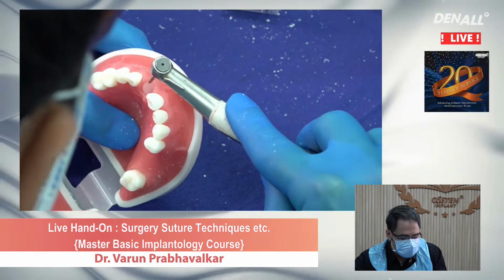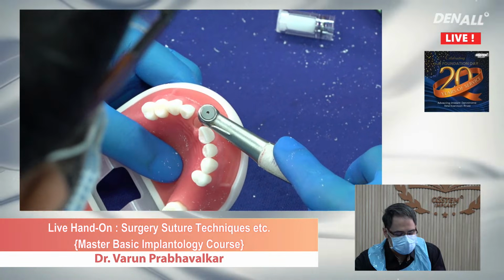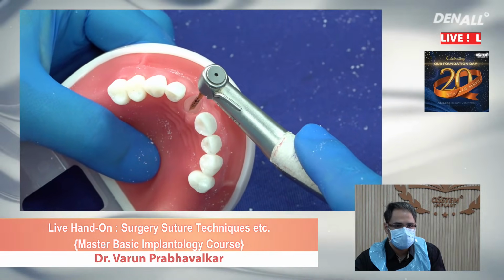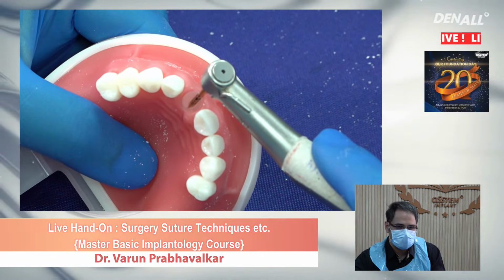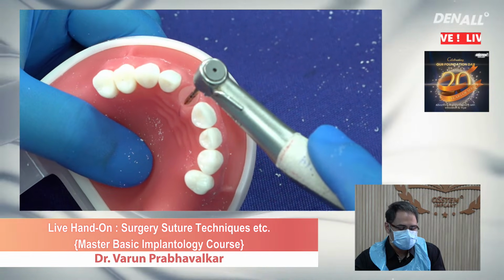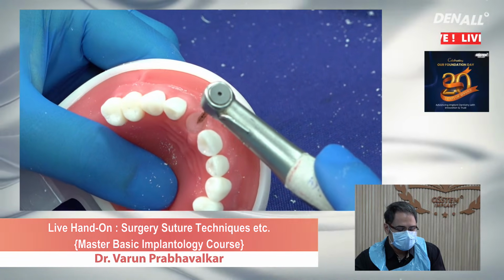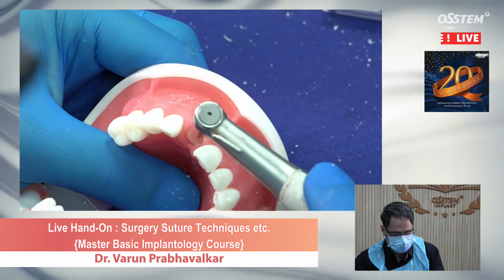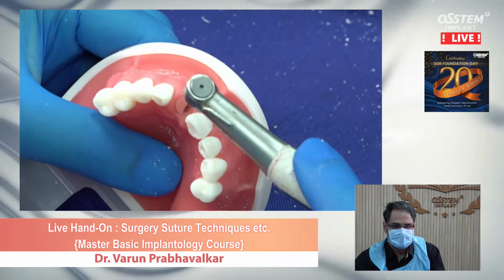Okay. Now, again, a 4 by 13 implant. What is suddenly done is that for the beginners, we need to create a purchase point. The purchase point is required because socket will always keep guiding your drill towards the apex. And because the socket is made up of a dense cortical bone like lamina dura, over here we need to overcome that by creating a notch and then creating an osteotomy through that.